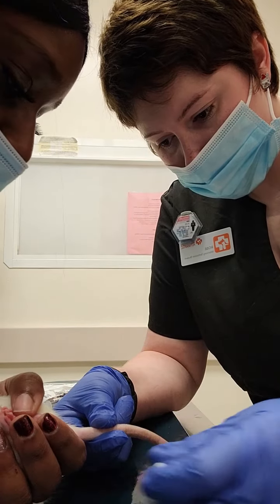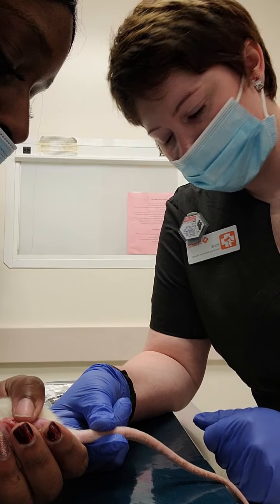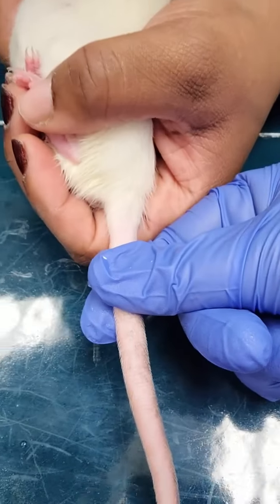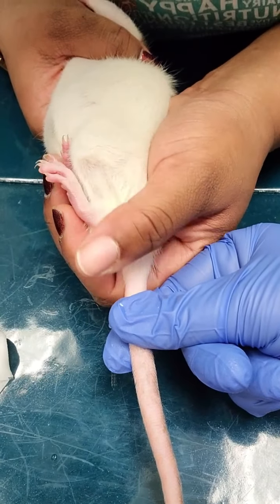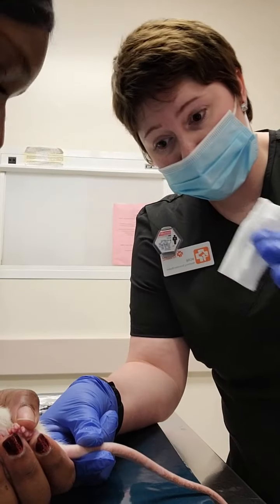Okay, so right now I'm just kind of occluding the vein so I can see it popping. Let's see if I can see the blue vein right there. I got some alcohol.